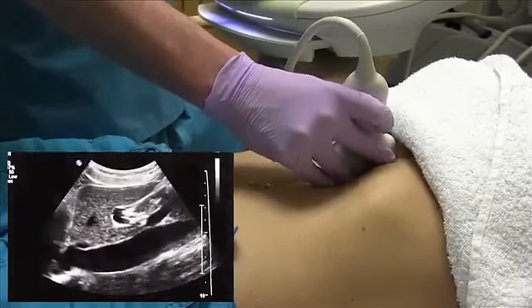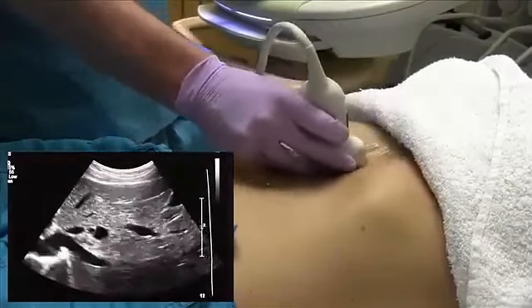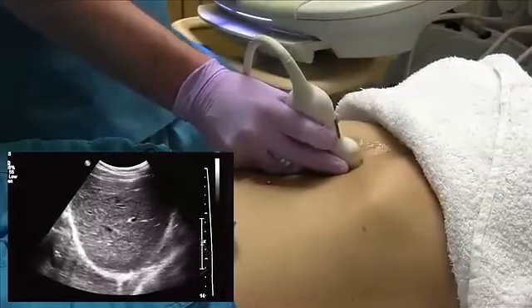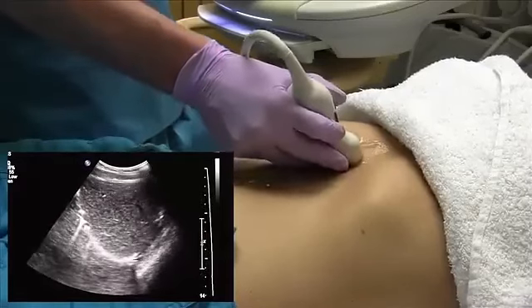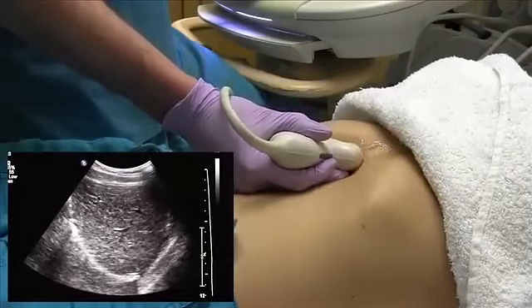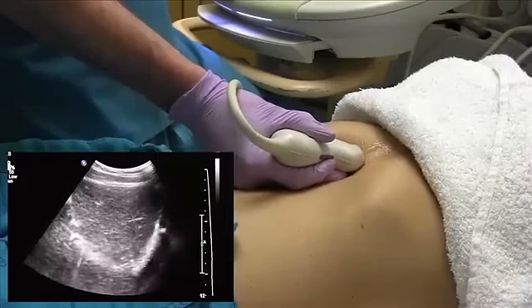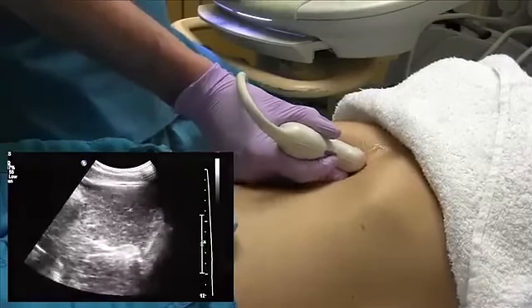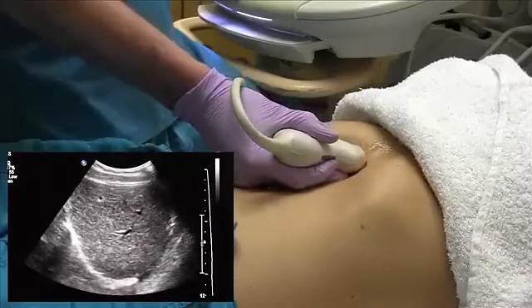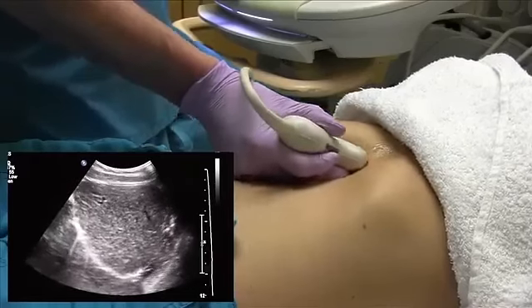From here we're going to start to come into the right lobe of the liver. And for that, I kind of follow this rib down a little bit. So technically, you're slightly obliqued. And what you want to make sure you do is you're pushing in and angling up underneath this rib. And what I do is I start at the dome of the right lobe and then take sequential pictures as we come down. So the first picture I get of the right lobe is just the parenchyma. You're above all the hepatic veins and portal veins.